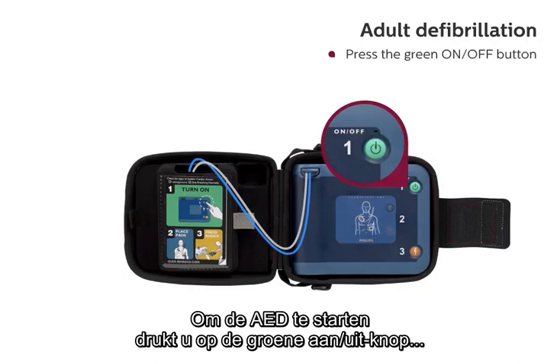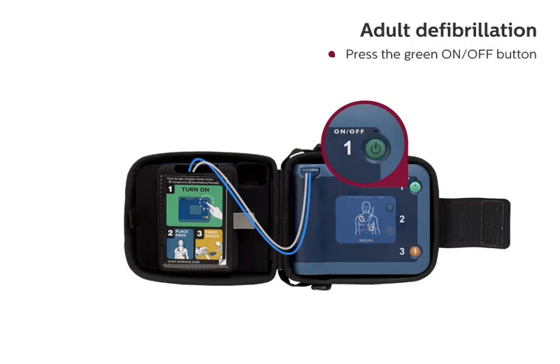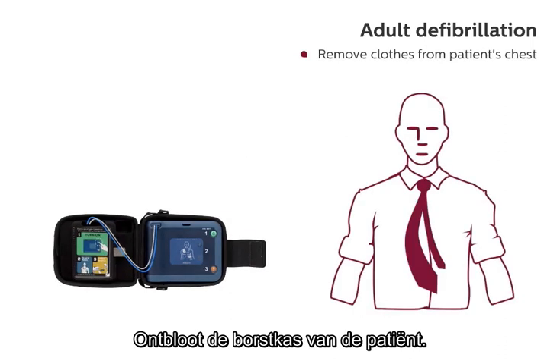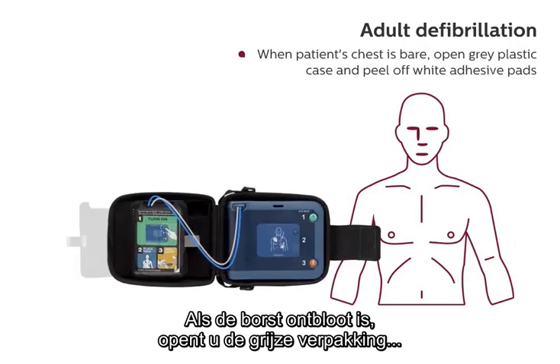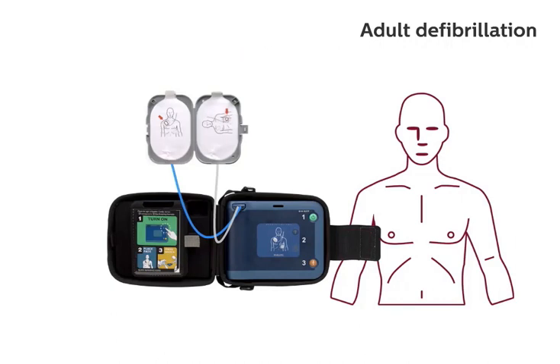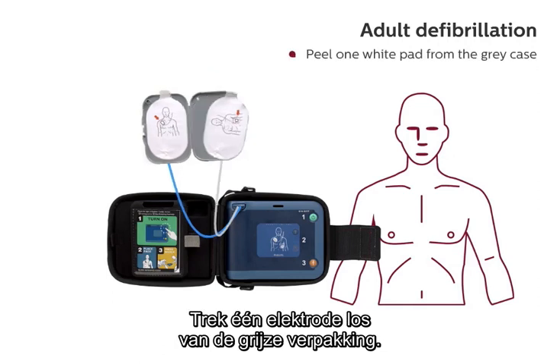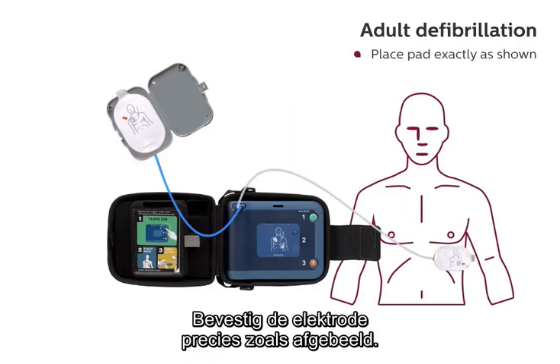To start the defibrillator, press the green on-off button and follow the HeartStart FRX's voice instructions. Remove clothes from patient's chest. When patient's chest is bare, open the gray plastic case and peel off the white adhesive pads. Look carefully at the pictures on the white adhesive pads. Peel one white pad from the gray case. Place pad exactly as shown.